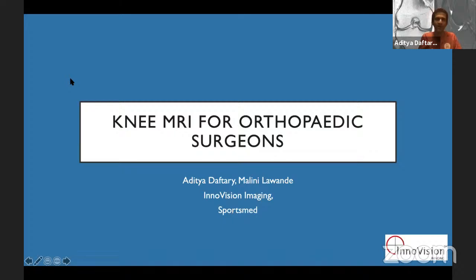Is it fibrocartilage? Is it hyaline cartilage? Is it similar to the other cartilage? Then a cartogram could have some use. But otherwise, in general, in my practice, we don't promote cartograms for anything, even though we get paid more for doing them.